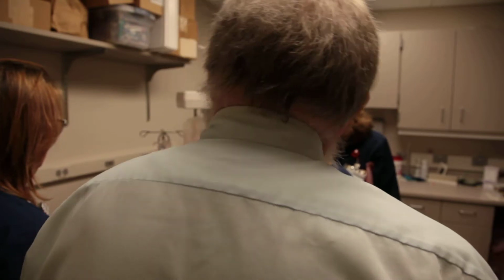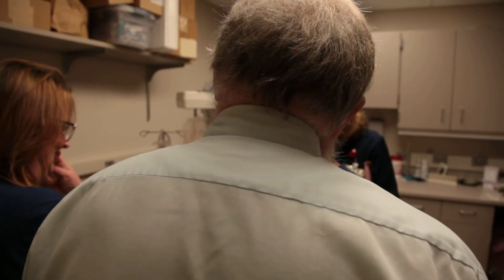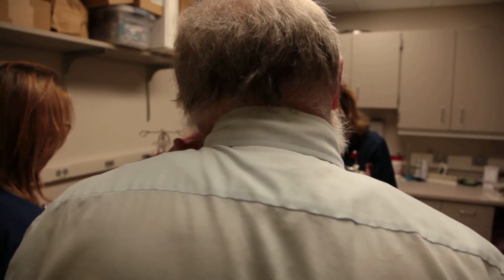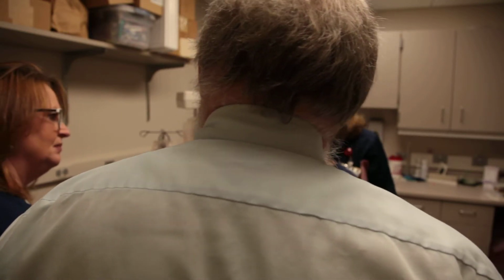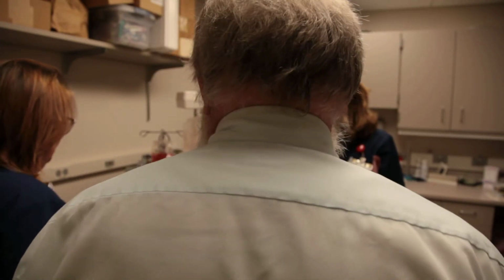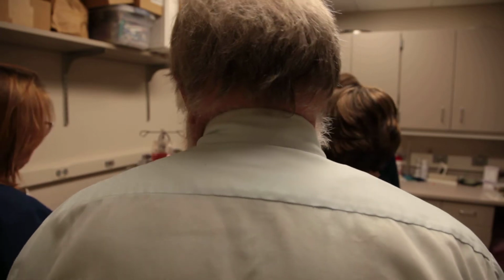So then we're gonna put the stopcock, because we gotta draw blood, draws more than likely. And then we're gonna put the blue thing on there with the spike. That's your blood. Put all of that on and then prime through that whole thing, to the tips. We can put our 4-way stopcock on our draw line, get that all primed out, and then hook it to the spike in the blood bank.